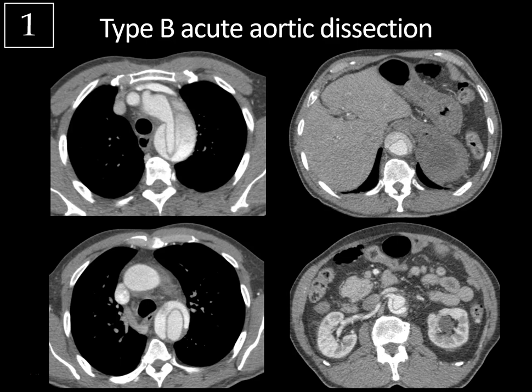When evaluating an aortic dissection, you want to differentiate between the true and false lumen, because if these are treated with an endoluminal stent graft, that graft needs to be placed in the true lumen. Typically the true lumen is smaller in size compared to the larger false lumen, because there are increased pressures in the false lumen.